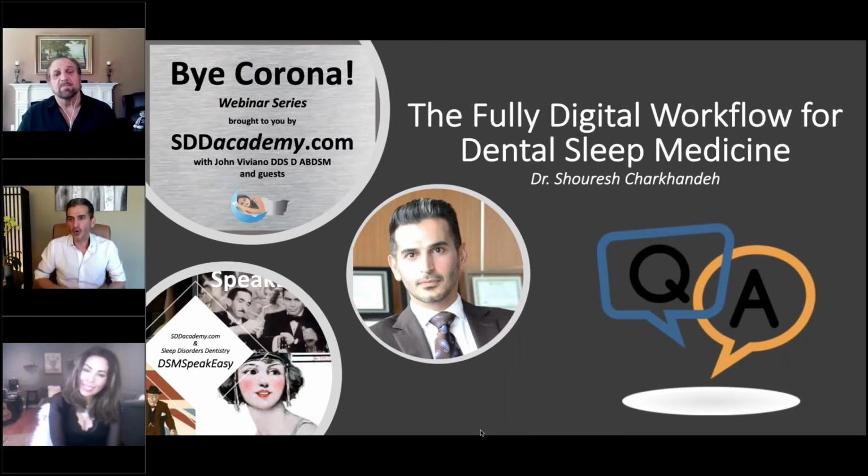And if that came across in my presentation, I'm going to take it back. But that's not what I said. It is not what we use for prediction. We have Matrix Plus for that. But we do utilize CBCT a lot for many other things. We've got to look beyond the volumetric, as I said: TMJ, joint, jaw muscles, nasal airway, sinuses, so many other things. There's a lot of value in 3D imaging. One of them happens to be the patient.